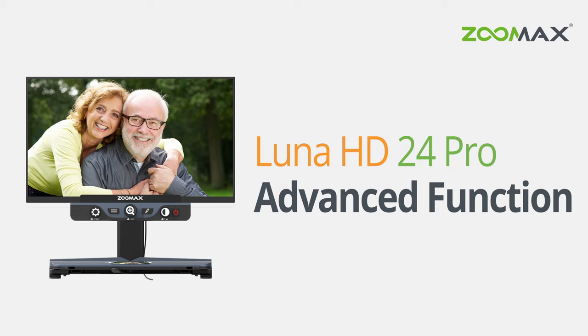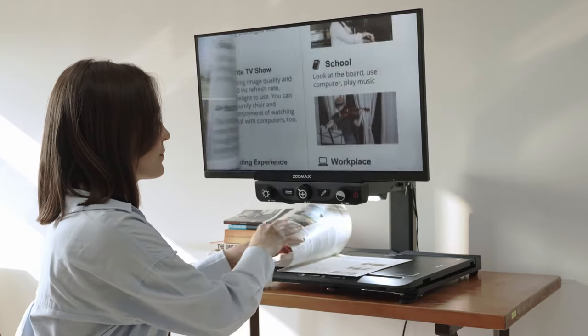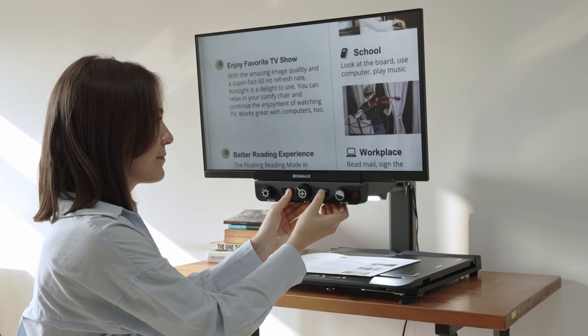The advanced mode provides more choices about color modes, reading lines and masks, and so on. Now let's look at the advanced function. Press the Focus Lock button and the Positioning Auxiliary button to activate the advanced mode.